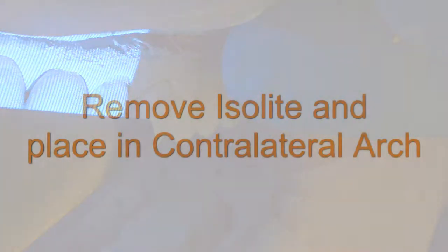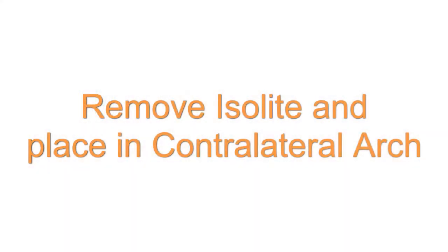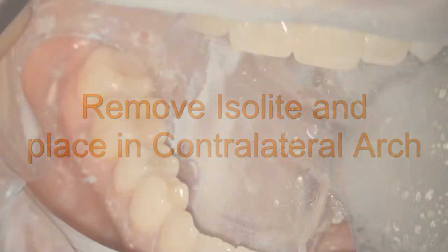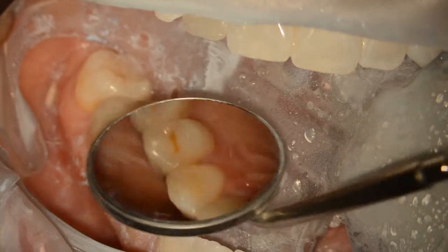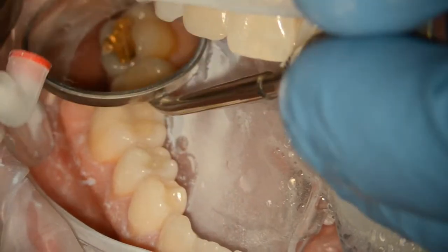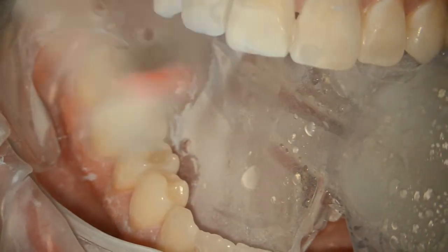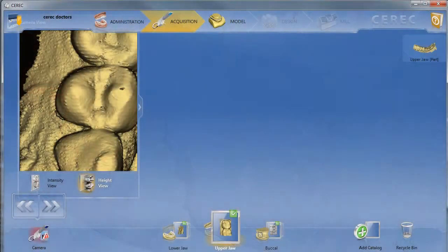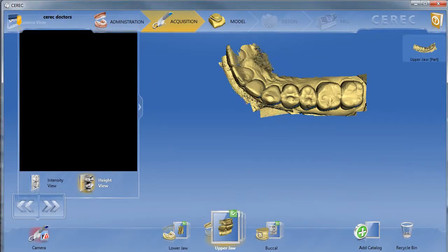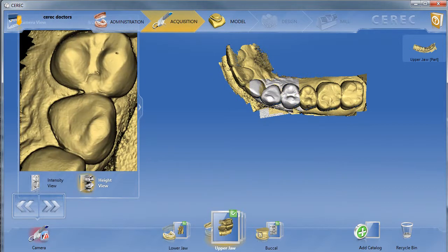I go all the way across to about the midline, across the midline, capturing the lateral and maybe even the canine, and we save these digital images in the save area on the desktop. Now we're going to remove the Isolite and place it on the opposing arch on the other side, and we're going to capture the same optical impressions of the upper jaw and the lower jaw on the right side. Here's the Isolite that's been placed on the right side of the patient's mouth, and we're going to go ahead and powder the upper jaw and capture those optical impressions. We need to make sure that we capture enough images beyond the central and all the way to the lateral so that we have common landmarks between the two different sets of images.